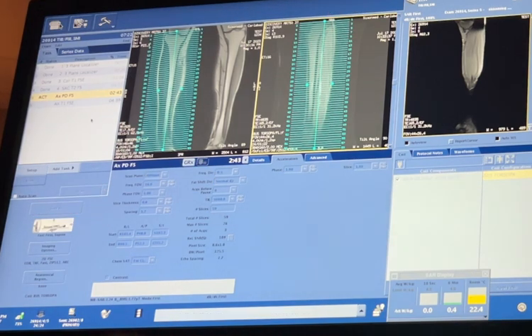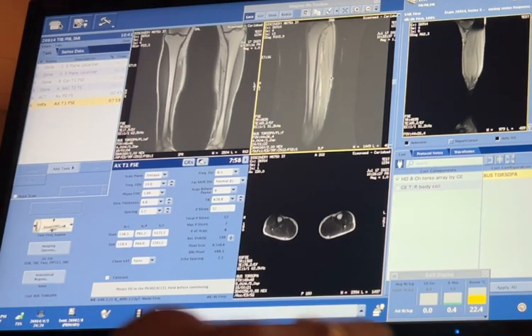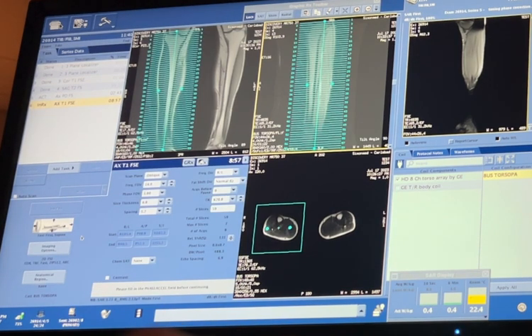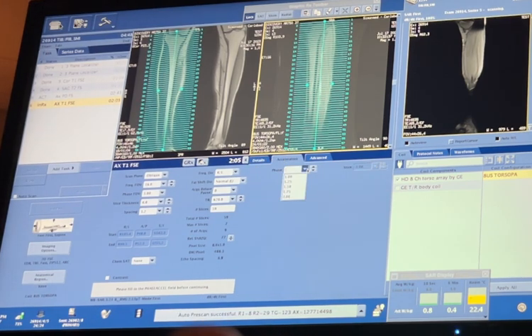Now let's do the axial T1. And I'm just going to have you copy it up top. Do I erase it first? No, you don't have to worry about it. Okay. All right, so let's close the axial view. Let's do NEX of 1 or 0.5. Let's do 0.5. And then phase of like 160. There we go. Acceleration factor of 1.